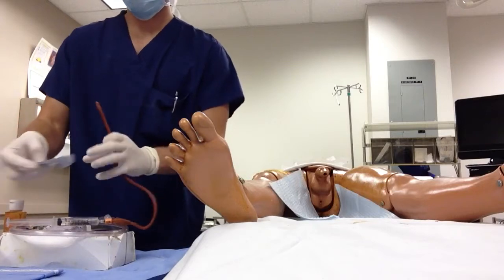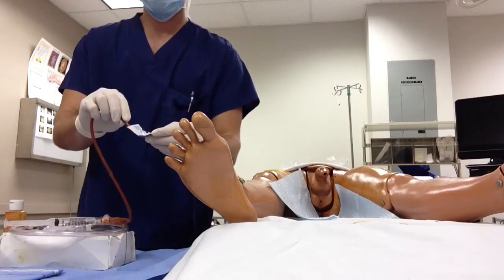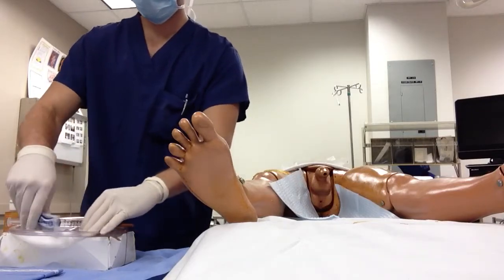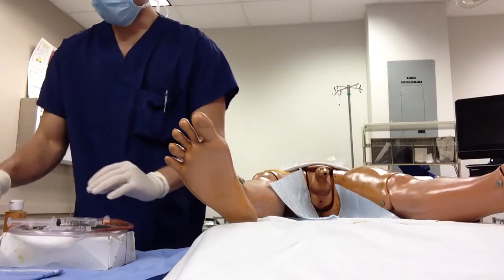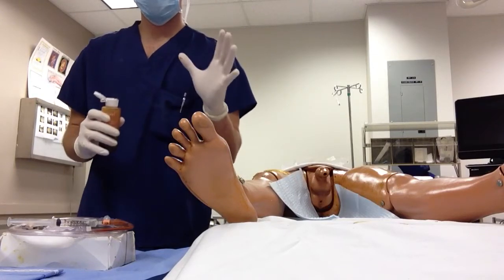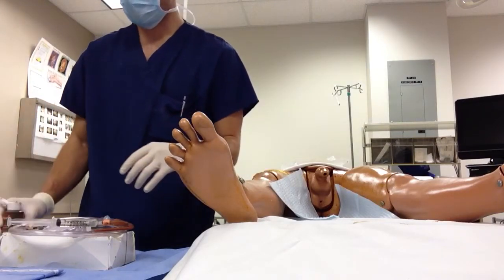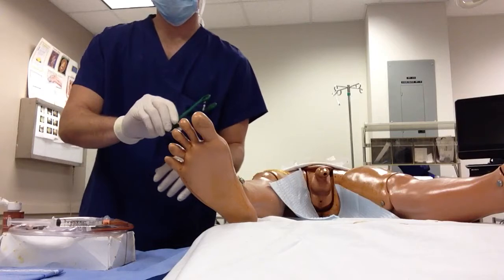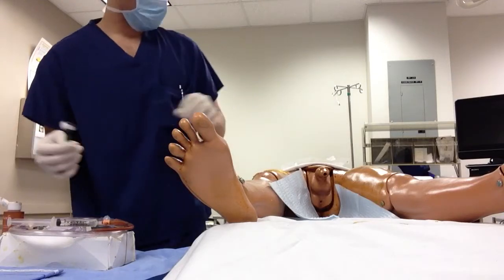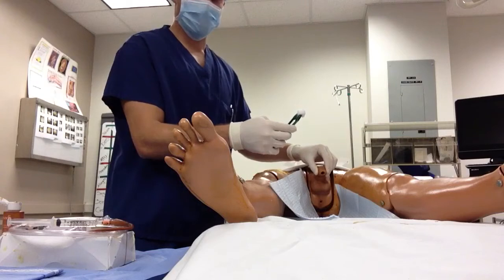Open up your lube and insert the end of the catheter in there. The lube allows it to slide more easily into the urethra. During this procedure you're going to have a dirty hand and a clean hand — my left hand will be my dirty hand. Put the solution over your cotton balls and grab your tongs with a cotton ball, then dip it in the solution. Grab the glans penis, or the tip of the penis, and hold on to it firmly.